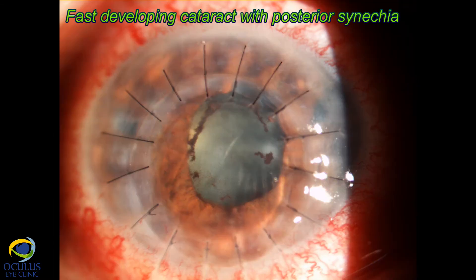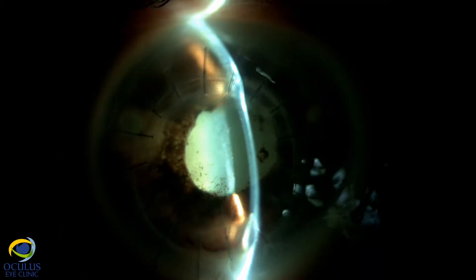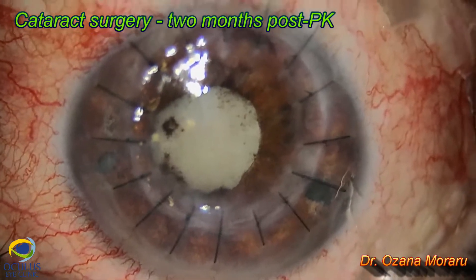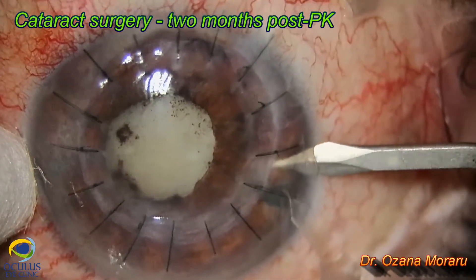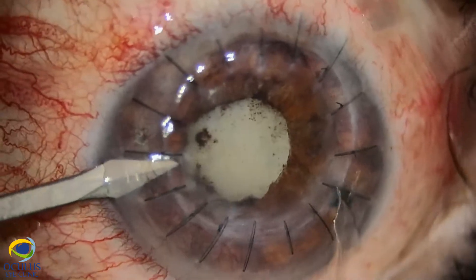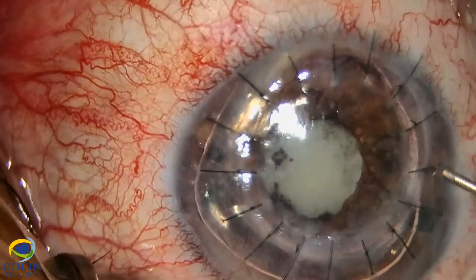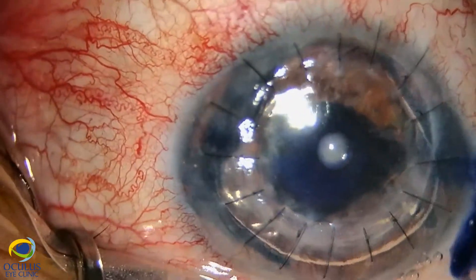The anterior slit-lamp examination looked fine the next days, but within a few weeks the patient developed a rapidly progressing white cataract with a fixed pupil and synechiae between the iris and the lens. We needed to perform cataract surgery two months after the corneal transplant. With all sutures in place, we needed to pay attention when entering with knives for paracentesis and the main incision to avoid cutting the sutures.